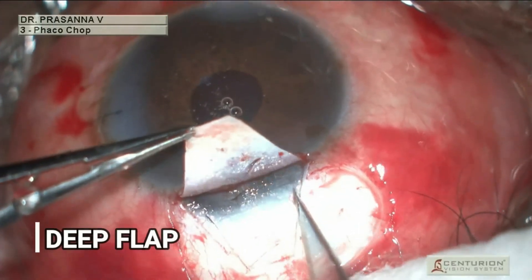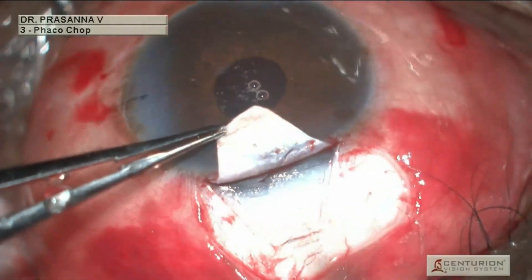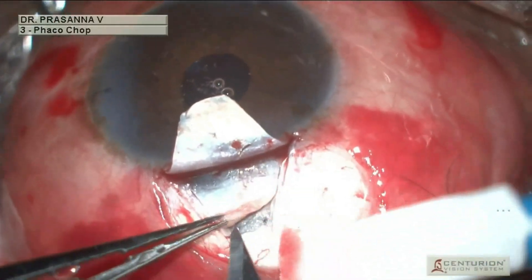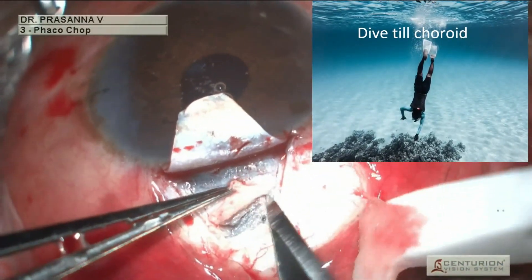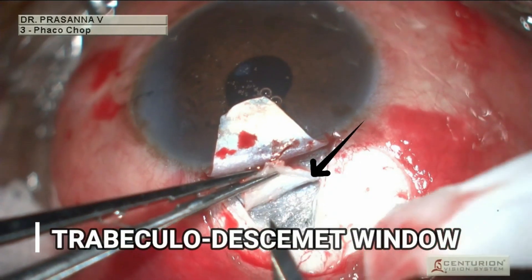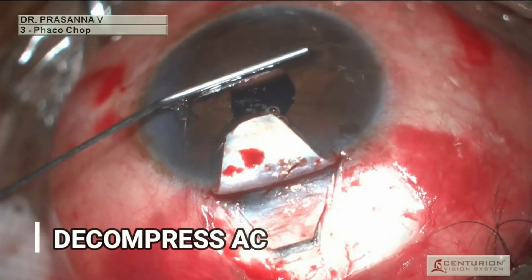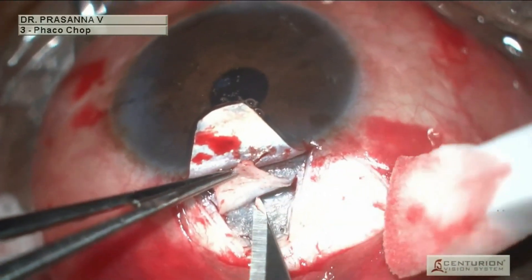We now proceed with deep flap dissection, which is the most critical and difficult part of the surgery. The deep flap should be deep enough to reach the trabeculo-Descemet window. Once we see this, anterior chamber decompression is done. Then the deep flap is excised and the trabeculo-Descemet window is exposed.